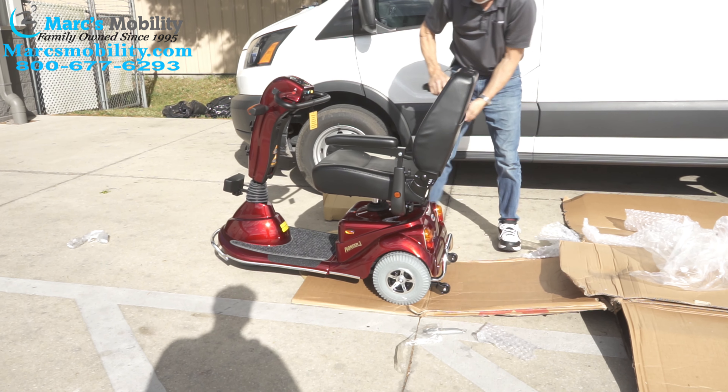The last thing left is your charger. Your charger is in the box — you can't miss it. The charger plugs right over here. This is where your charger would plug in. Move this cap sideways, then down or up — there's your plug to charge. This cap is just to keep it clean.